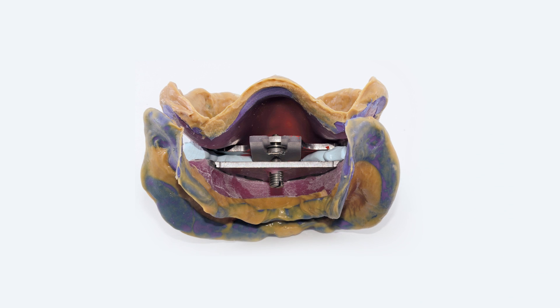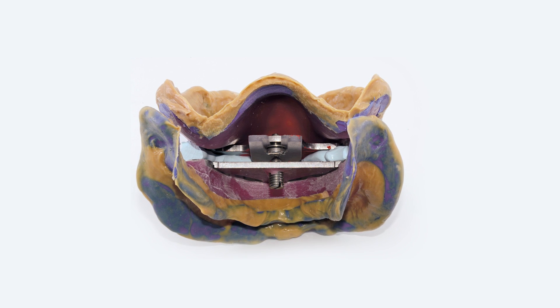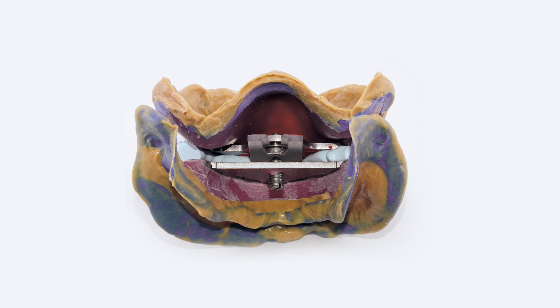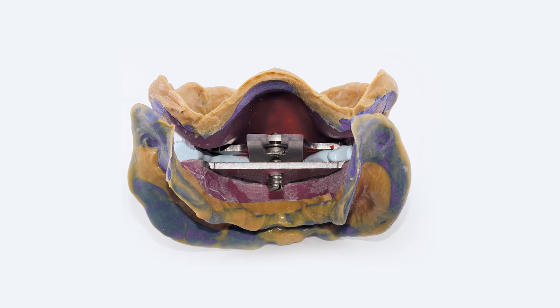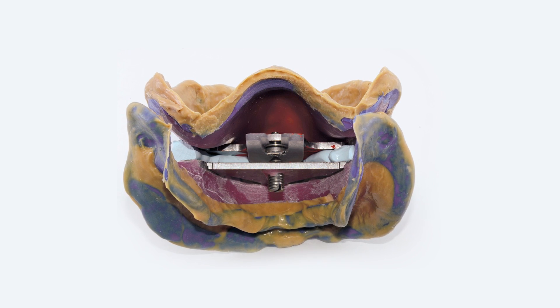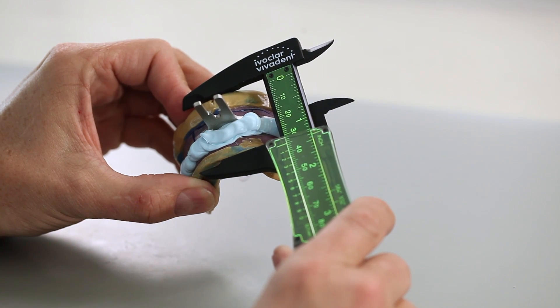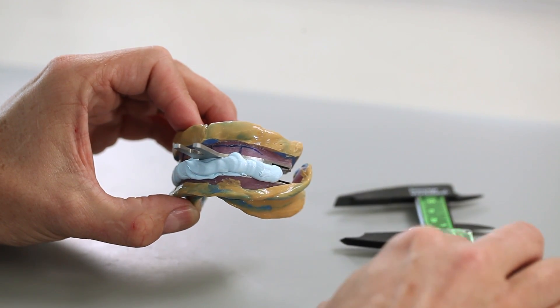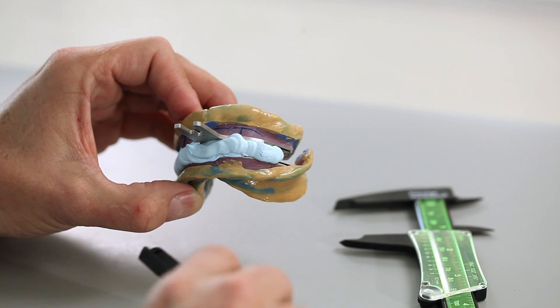The dental technician receives two functional impressions which are secured in the correct occlusal height and centric position by means of the intraoral registration of the Nathometer M. Measure the patient specific intervestibular distance in the anterior region and note it down.